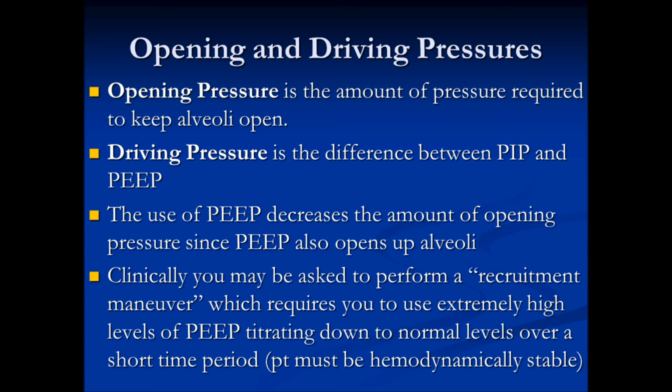There's no hard and fast rule on what numbers to use. This will all be done by a neonatologist or a pulmonologist who's right at the bedside, who will be standing there looking at the monitor, looking at the pressures, looking at the waveforms of the hemodynamics, and determining whether the patient could stand the time frame.